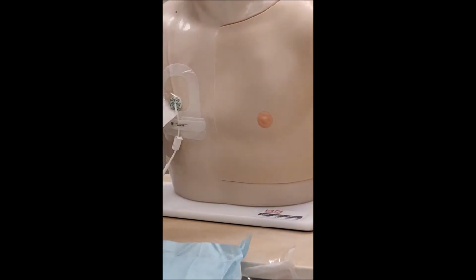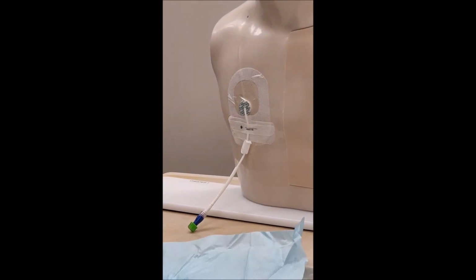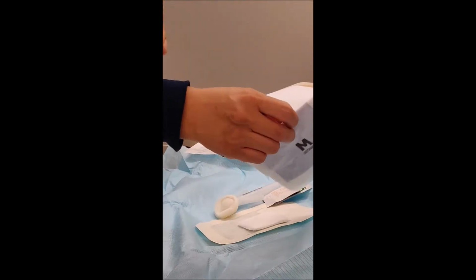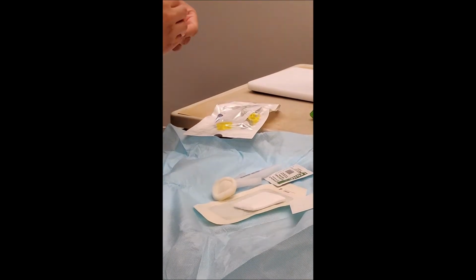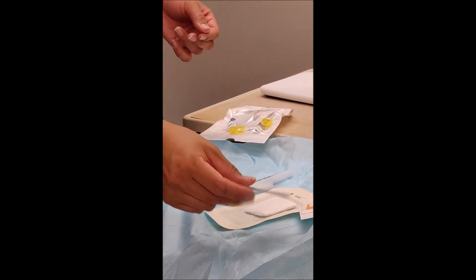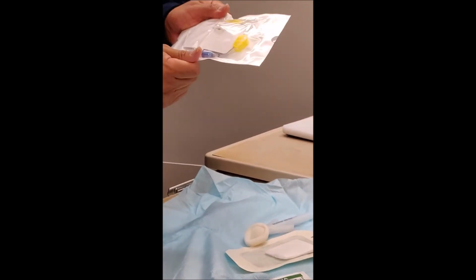Okay. And it also comes with ChloraPrep, gloves, dressing, gauze in case we needed, extra strips, alcohol pad, and then again skin protectant prep pad for the skin as well. So the first thing is, we're going to make sure that we have our needle access.